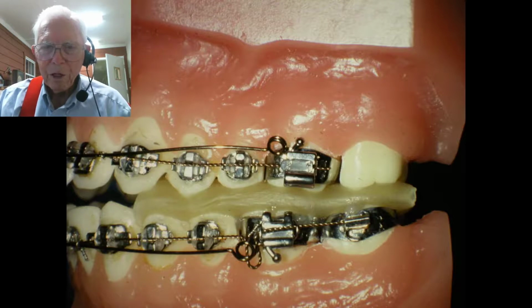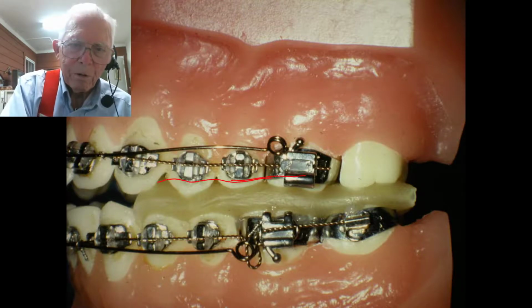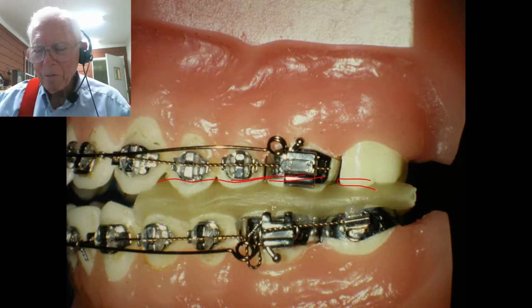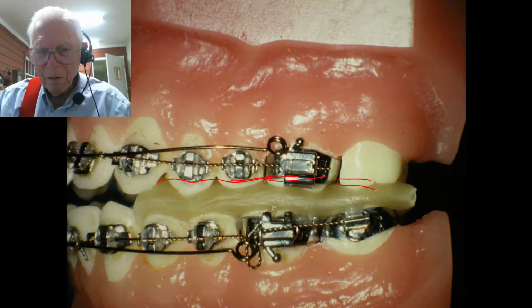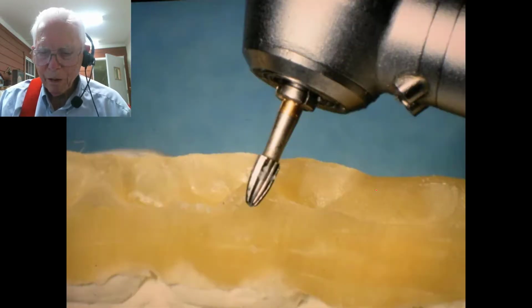And now we let this harden at that point, or you close the tooth. You've got some Vaseline on these teeth up here, or something that keeps it from sticking to that. So if you stuck it to the teeth, you'd have a lot of problems there. But anyway, we mash the teeth down to the height we want, and now we'll let it harden good, and then we put it on the other side of the mouth.